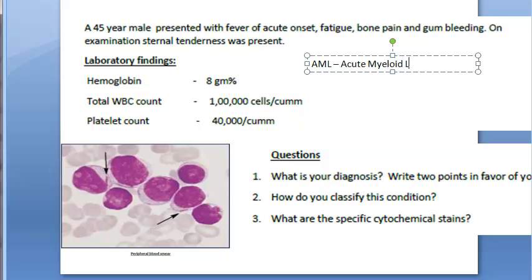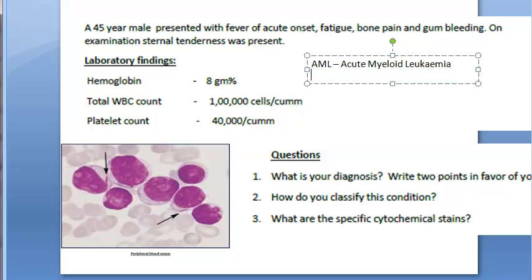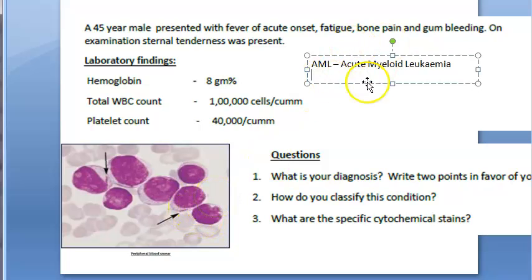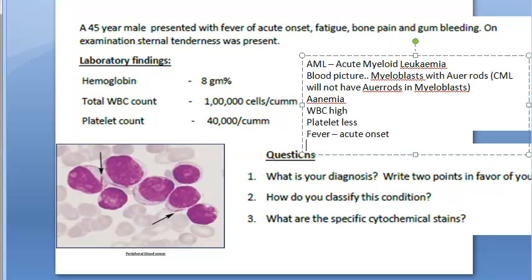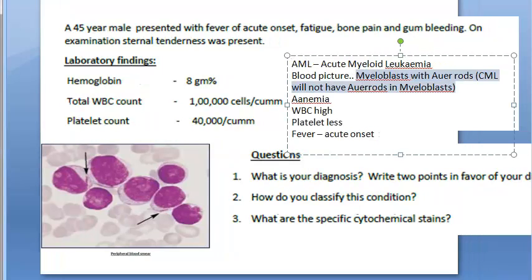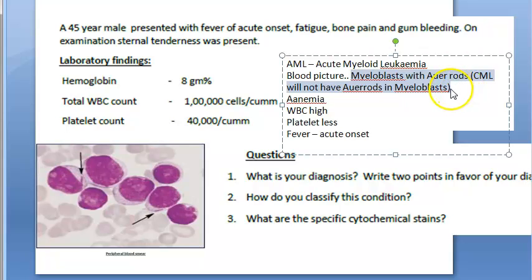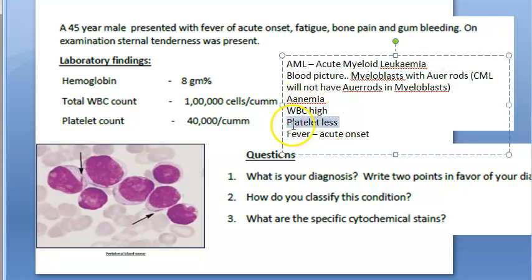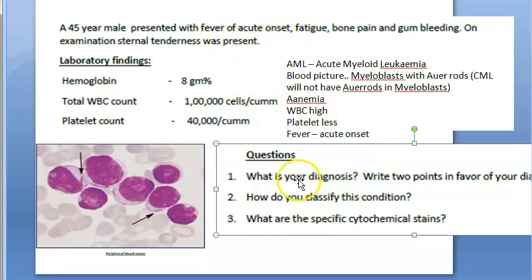In the blood picture you can see myeloblasts with Auer rods — these cells are not supposed to be in peripheral blood. In CML there will be no Auer rods in myeloblasts, but here you are seeing Auer rods, so definitely AML. The picture shows anemia, very high WBCs, low platelets, and acute onset fever. Diagnosis: Acute Myeloid Leukemia.